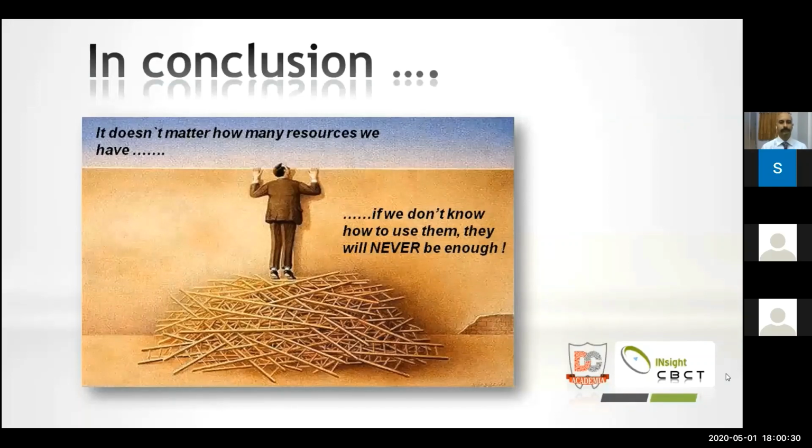But there could, of course, be situations where you may not be able to achieve it. Those individual situations would require more detailed planning along with the software, where you can really plan keeping all those other limitations in mind.